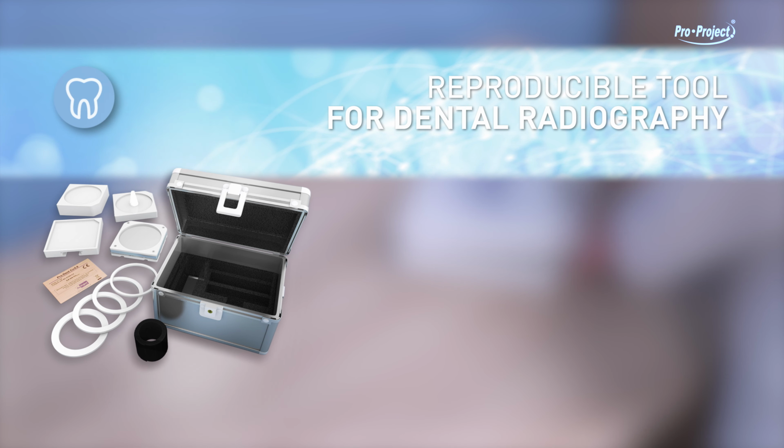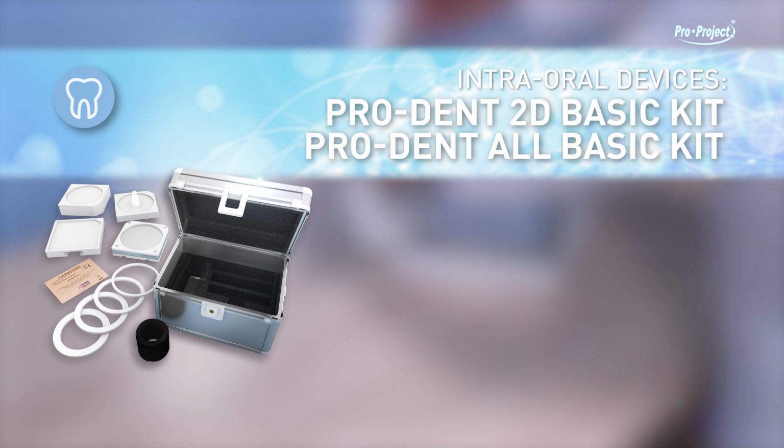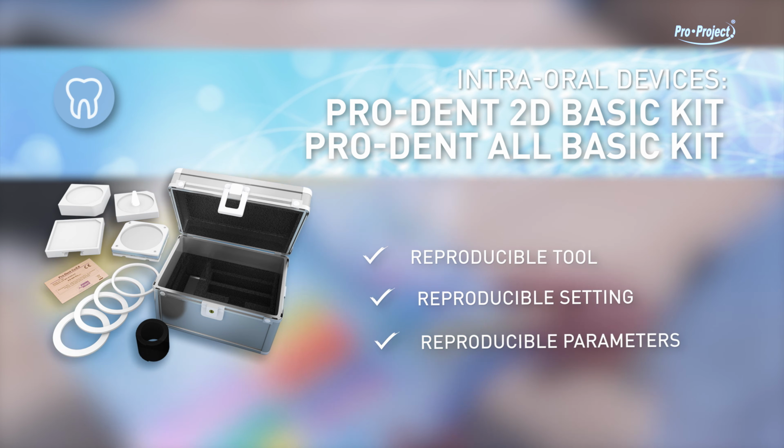Reproducible tool for dental radiography, intra-oral devices, Pro-Dent 2D Basic Kit, Pro-Dent All BASIC Kit. Reproducible tool, reproducible setting, reproducible parameters.